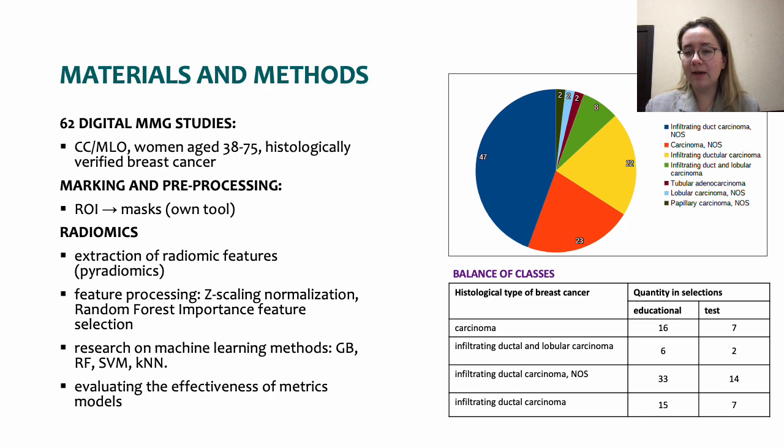Graphic markup was carried out by students of medical university under the guidance of radiologists of the Center of Diagnostic and Telemedicine in the IMEG program. The tool for extracting masks from doctors' markup was developed in-house by the center in Python. The class balance and the distribution of masks by histological subtypes is presented on the slide.